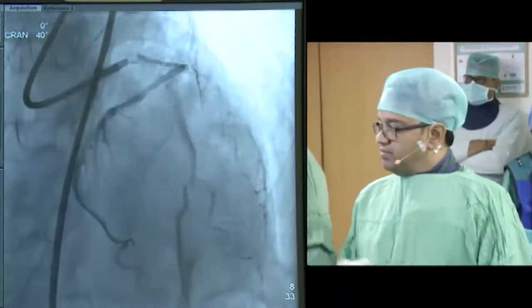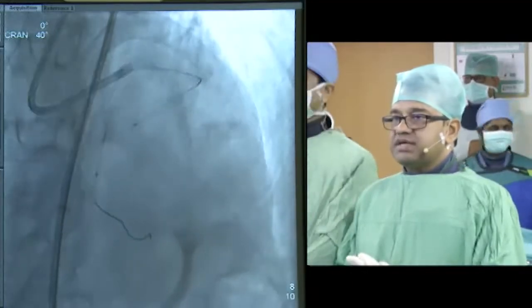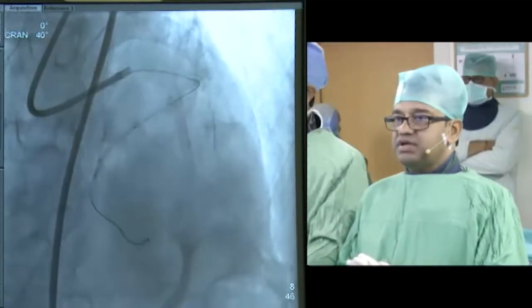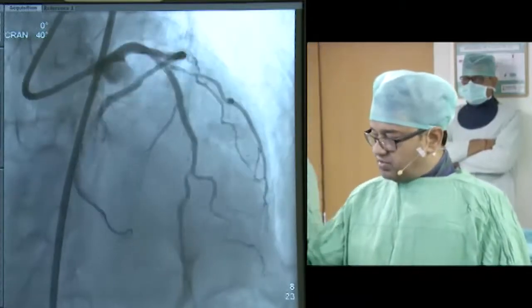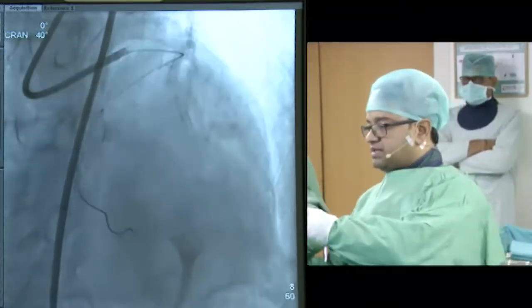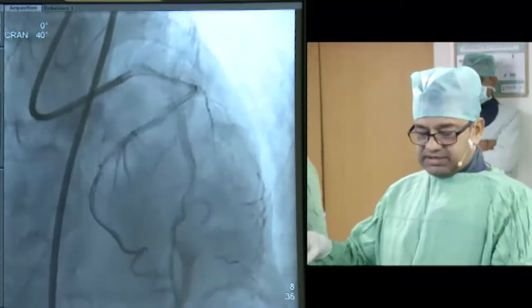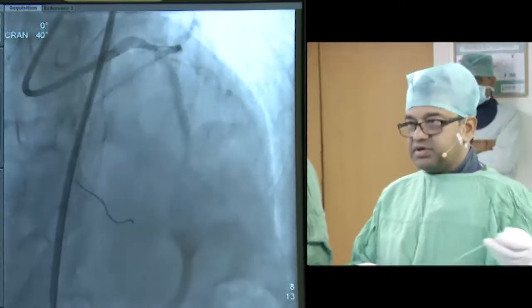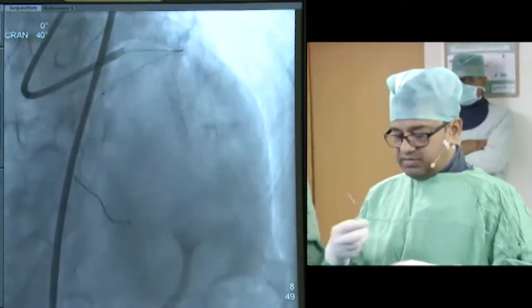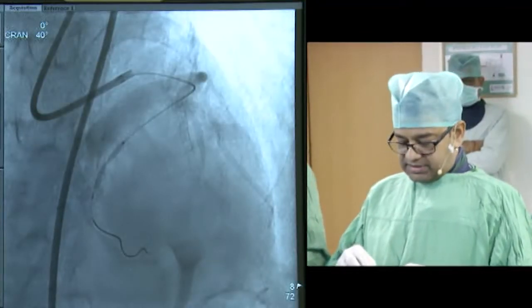So this is a Meres 2.5 into 24 balloon, and as you know, we can up the size to almost 0.75 millimeter if need be. We'll first implant the Meres stent, the absorbable scaffold. This is from Meril Life Sciences, almost 100 micron thickness, and we had done a study with Indian patients. We recruited around 16 patients and had a very good outcome. In fact, today we have posted the 2-year follow-up angiogram of the Meres, the proximal LAD we had done.